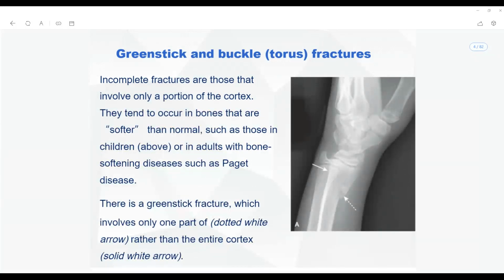When you are trying to look for problems related to the physiology of the bone, at least try to include the epiphysis, metaphysis, and the diaphysis, which means I am going to take the x-ray of the whole bone. So all the bone should be present.